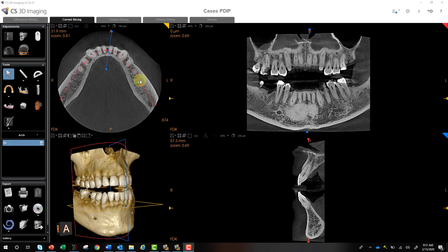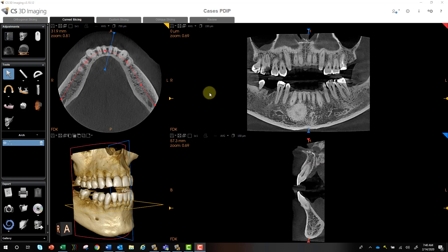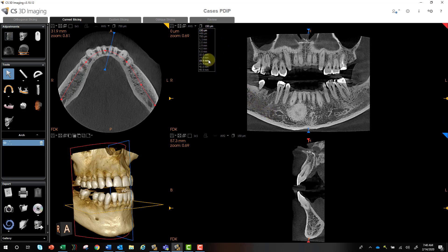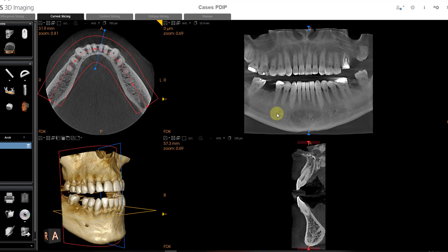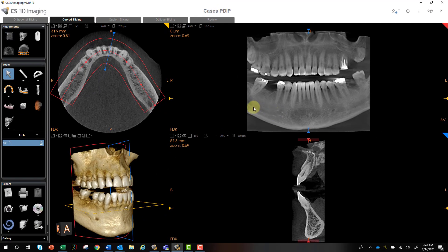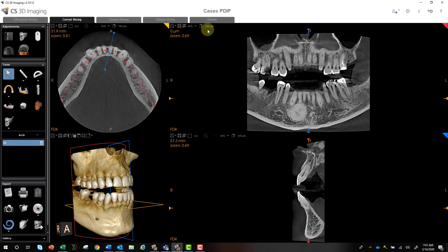Now that we've mapped our panoramic curve, we can go ahead and map our nerve. I want to map the nerve at its thinnest point so the nerve becomes much more prominent. If I mapped it at 20 millimeters, I can see it and the height might be correct, but when I mark it, it's not going to be accurate from a buccal-lingual perspective. So I do want to change it to a thinner slice, and then I can begin to map the nerve.